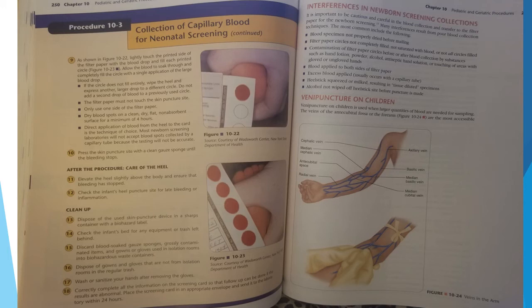Blood applied to both sides of the filter paper. Excess blood applied usually occurs with the capillary tube. Heel stick squeeze or milk results in tissue diluted specimens. Alcohol not wiped off the heel stick site before the puncture is made.